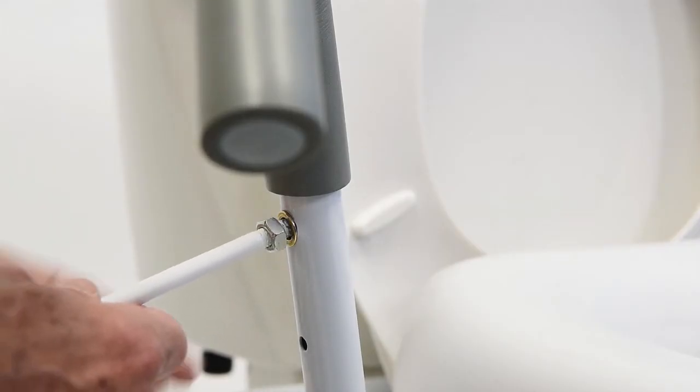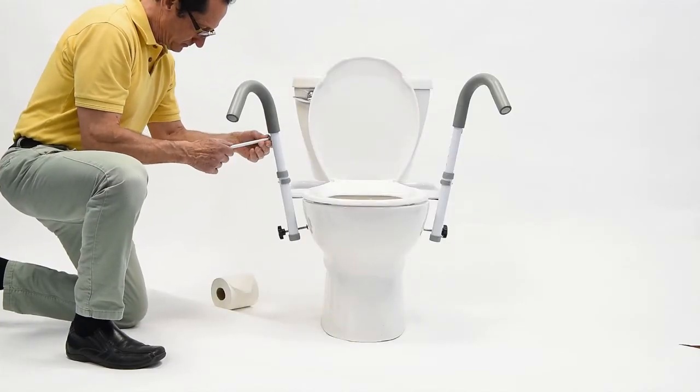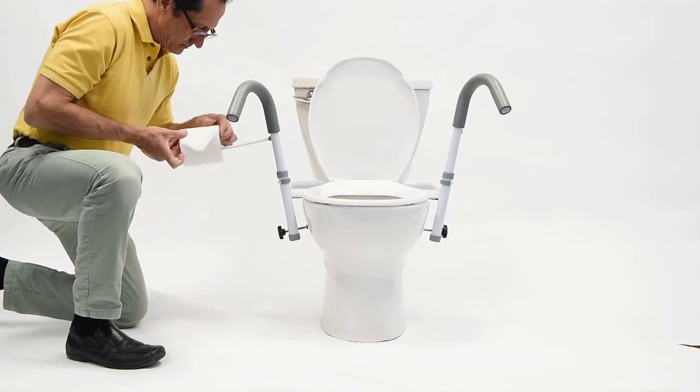The toilet paper holder can be installed either left or right as needed and can be attached by simply inserting the screw portion into the receiver and tightening by hand.